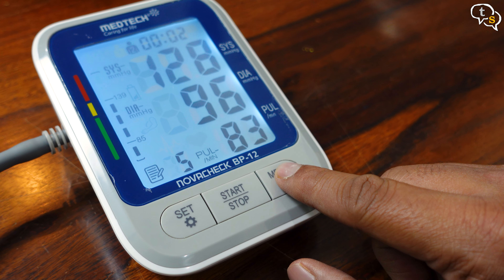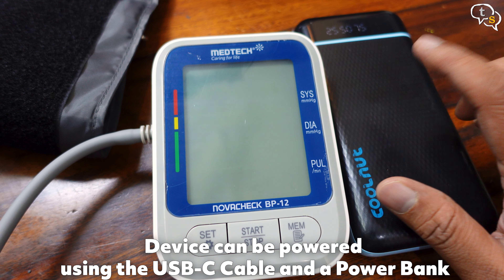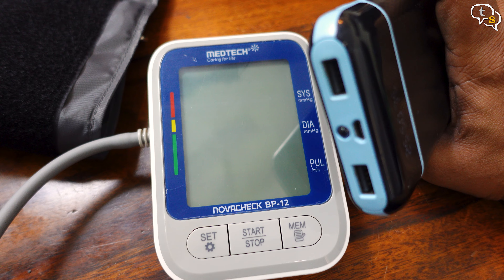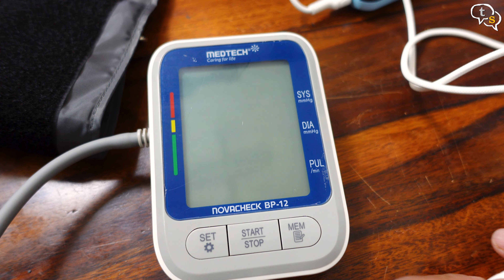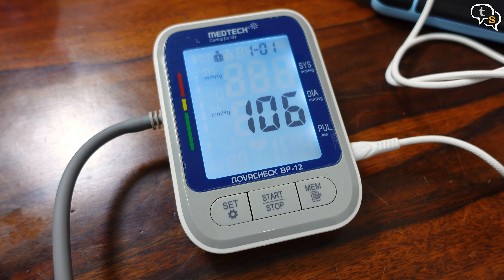The memory function allows you to check earlier readings which are stored in the memory. Let's try powering the device using the USB-C cable provided — you can connect it to a power bank. I have removed all the batteries, so you can see that the device is still working even without the batteries within.